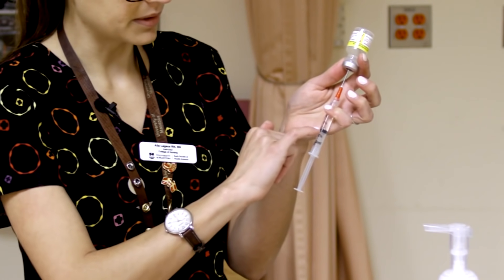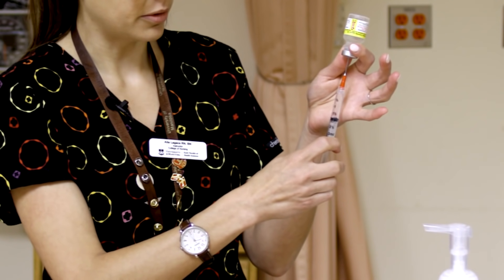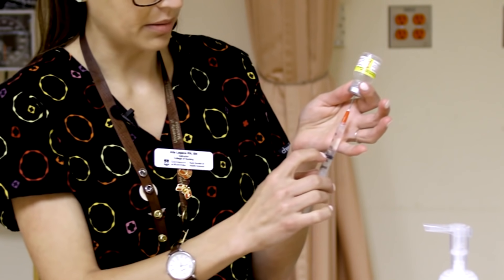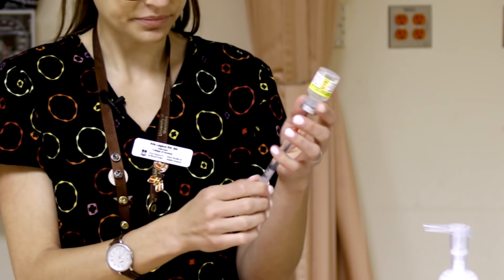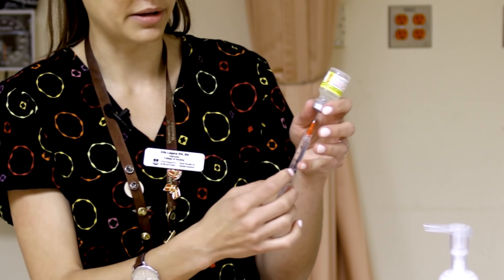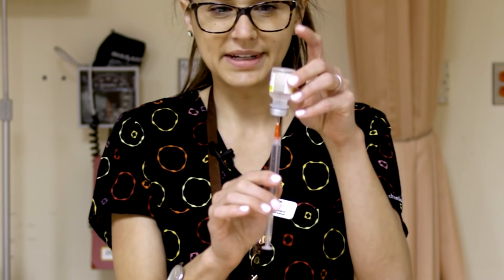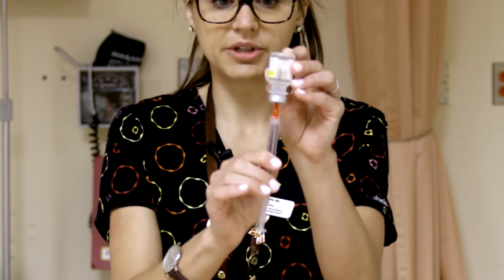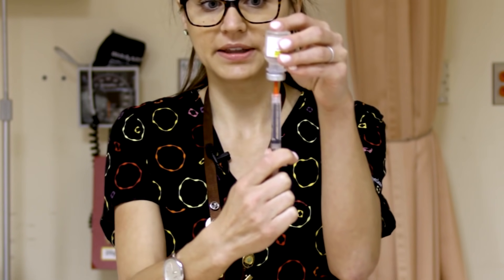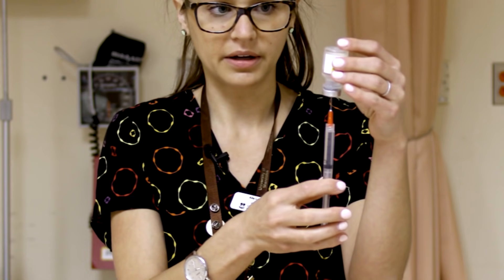Pull back and you'll see some air bubbles. The one at the top can easily be pushed back up into the vial and then pull back again. For the bubble at the bottom, take out a little bit of excess — use the back part of a pen and flick it hard with a wrist-flicking motion to get rid of those bubbles. You also need to make sure your blunt fill needle is submerged in the solution, because otherwise you'll just be drawing out air and getting more bubbles.